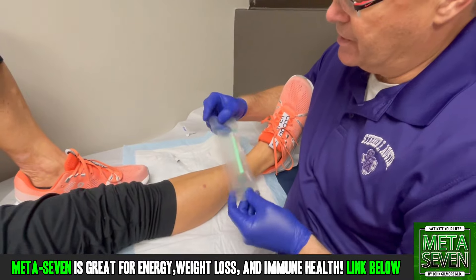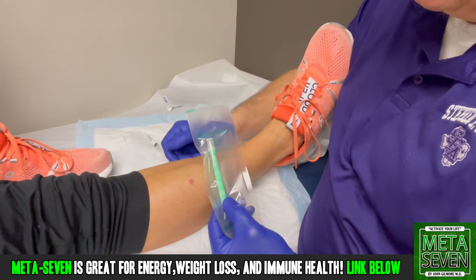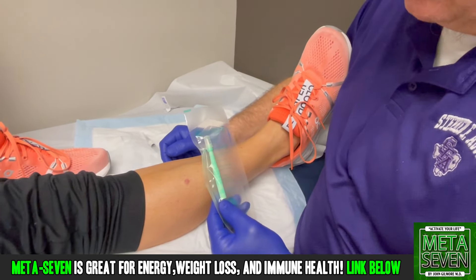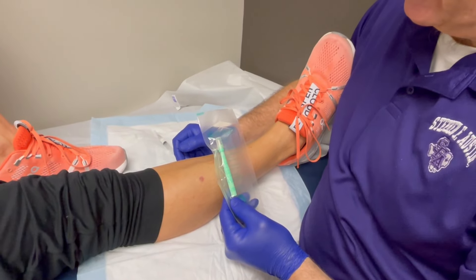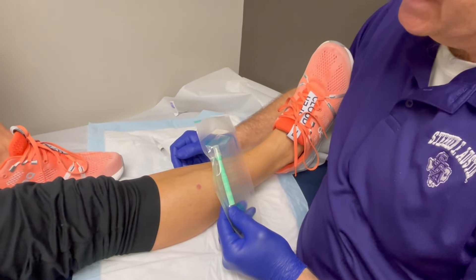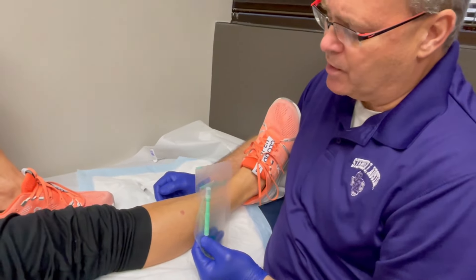A punch biopsy is a small tool that we use — a biopsy punch — to remove a portion of a lesion and send it to pathology, generally to have it sectioned and examined under a microscope for a specific diagnosis.